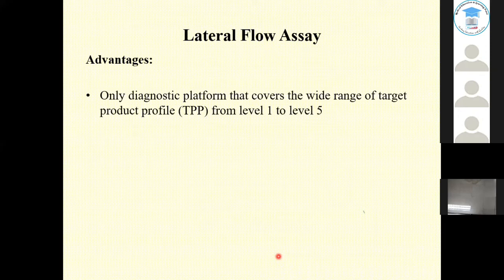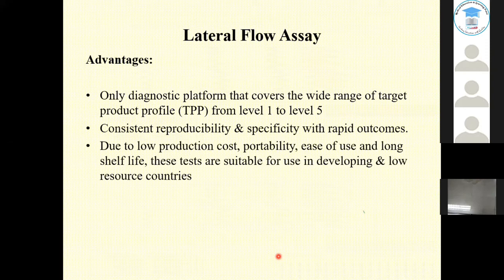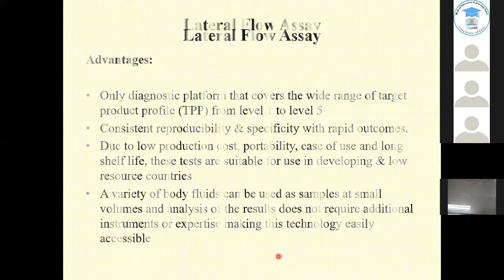So what is the advantage of using a lateral flow assay? It is the only diagnostic platform that covers a wide range of target profile from level 1 to level 5, has consistent reproducibility and specificity with rapid outcomes. Due to low production cost, portability, ease of use, and long shelf life, these tests are suitable for use in developing and low-resource countries, and a variety of body fluids can be used as samples at small volumes, and analysis of the results does not require additional instruments or expertise, making this technology easily accessible.